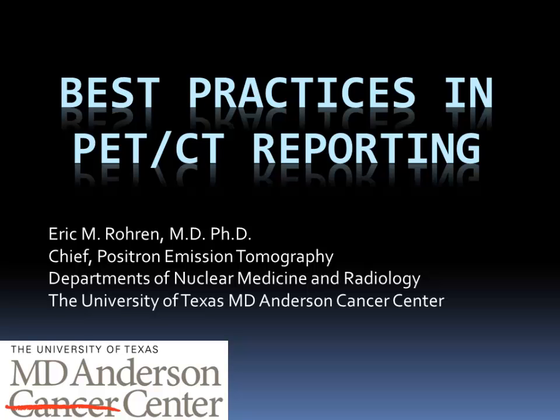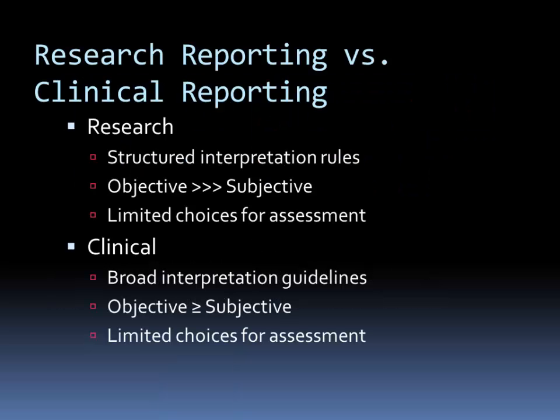The first presentation today is what I consider to be probably one of the most important things when it comes to our function in the role as nuclear medicine physicians, and that is reporting. So as much effort as we put into the acquisition of our scans and the performance of our scans, ultimately it's the reports that go out to our referring clinicians that bring value from what we do to the care of our patients.